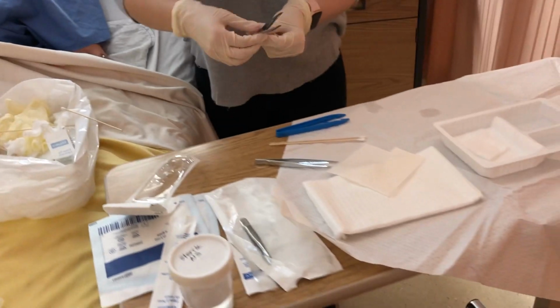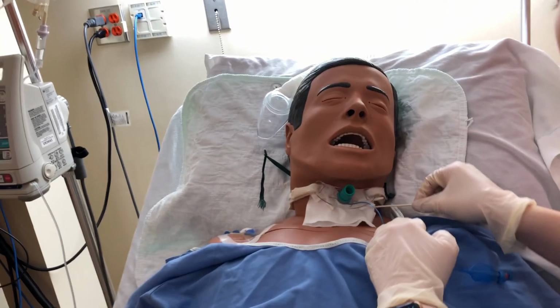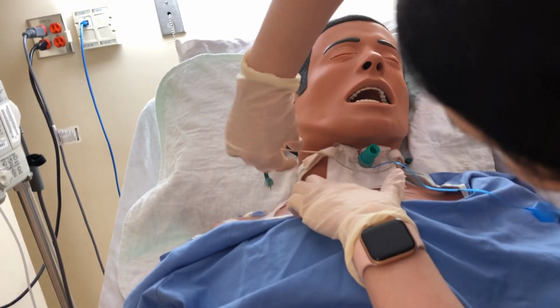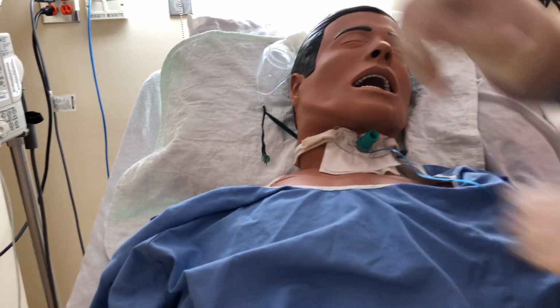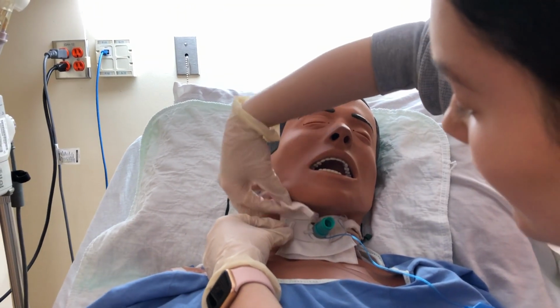Okay, and I'm just going to take a cotton tip and push it up. And now that I have that, I'm just touching the outer portion.